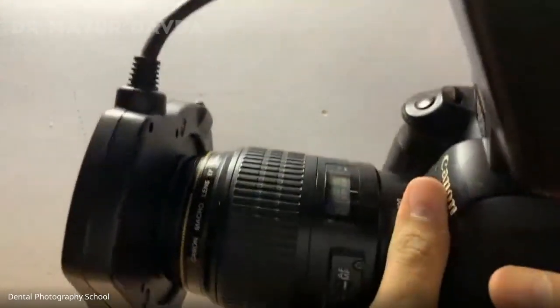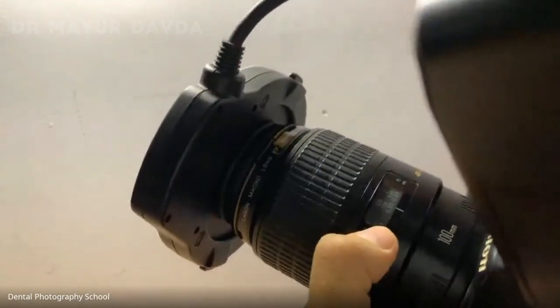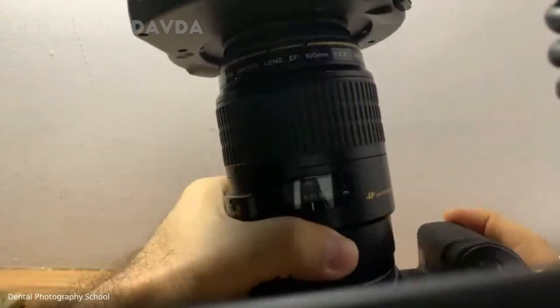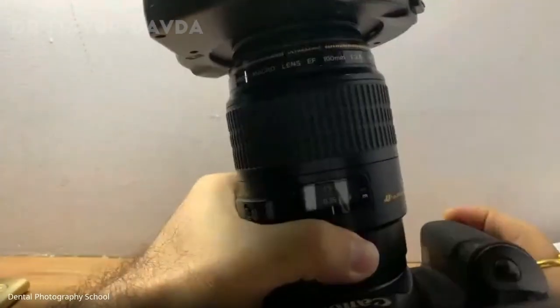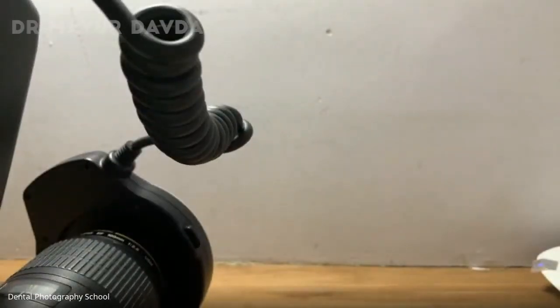I don't want to go into the details of it because it's already there on YouTube. You can take the liberty of going to my YouTube channel, and my MR, which means magnification ratio, is set at 1:1.5 as confirmed by all of you. You can see the yellow color number. Yeah, it's 1:1.5. So I just need to call my patient in my dental chair now.